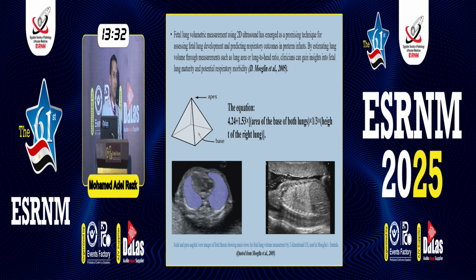And actually, I'll give you a very important tip which helped me through the process of learning fetal anomaly scans. You have to correlate the ultrasound and even the CT and the MRI. So you don't look at any anatomical organ in the body in just one modality. It would be better to correlate with MRI images, and get used to the fetal images of MRI, and even the adult, and get acquainted with the basic views, such as the 4-vessel views, the 3-vessel views, and the 4-chamber views. Those are very good tips to perform the scan.